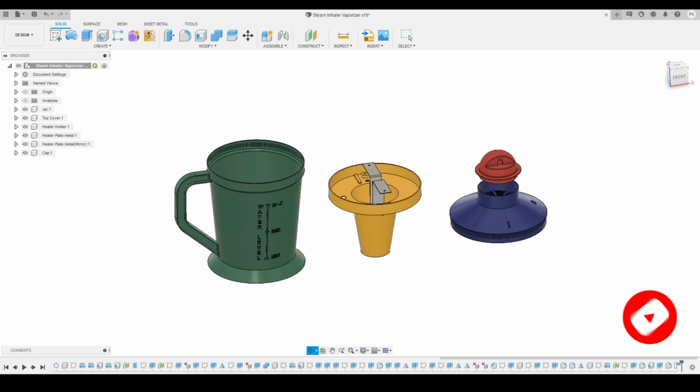So here you can see I just created this sketch and now I will make this line and the origin coincident. So I had applied the constraint, then I will make this line a vertical line. So I had applied the constraint. What you have to do is just select the entities that you want to specify in a certain position and then apply the constraint. So this is how it works.